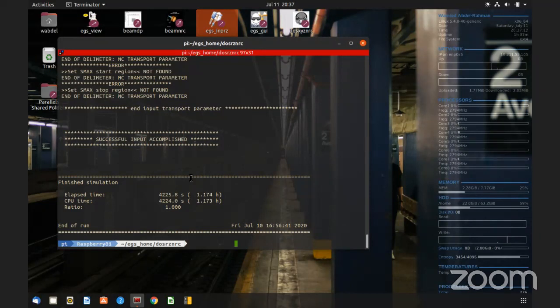And then in Slurm you define, for example, I have 3 Raspberry Pis, each one has 4 cores. So I defined in Slurm that you can run 4 jobs on each. When I submit to Slurm, I'm going to split into 12, so Slurm knows that there are 12 jobs. Then it will see which cores are available and submit the jobs to be run there.